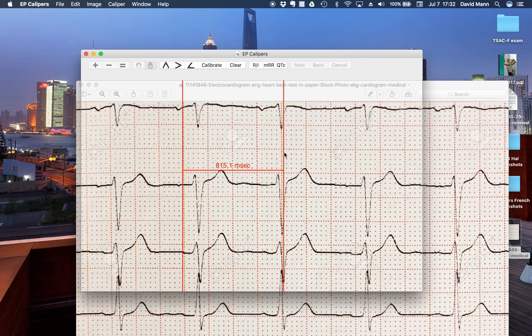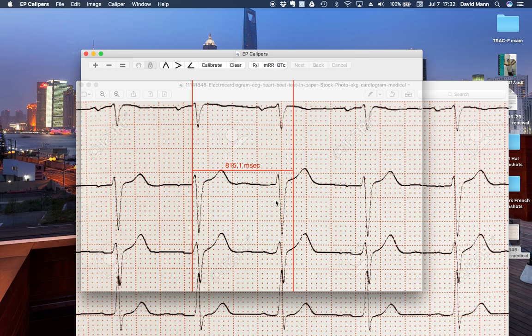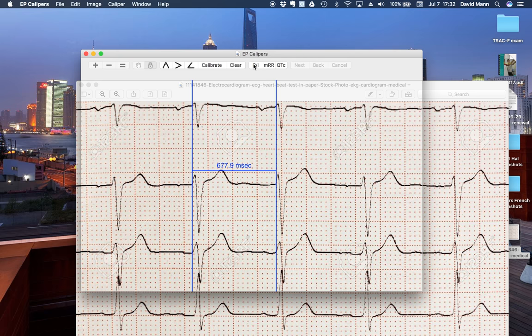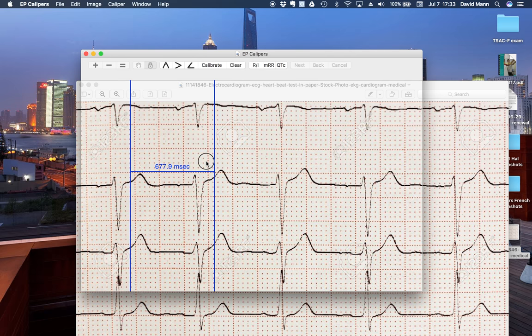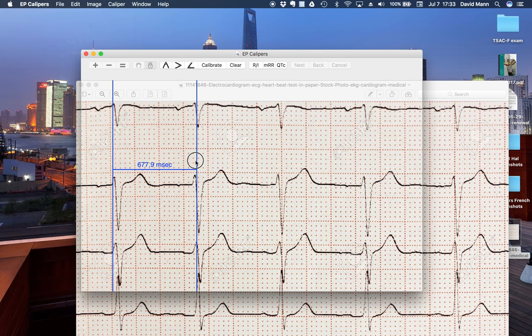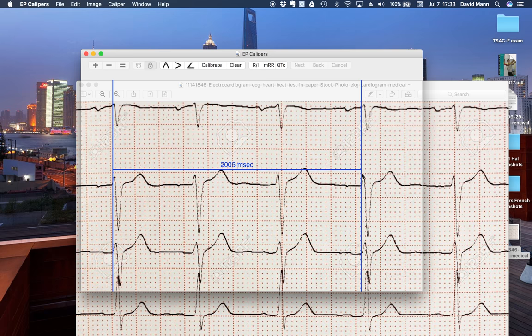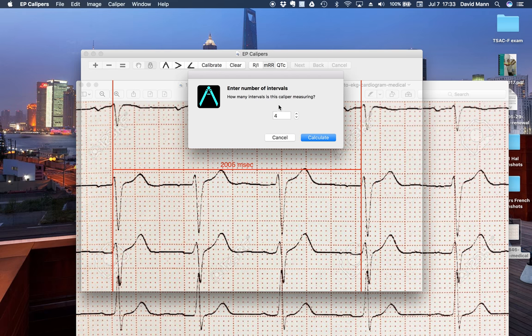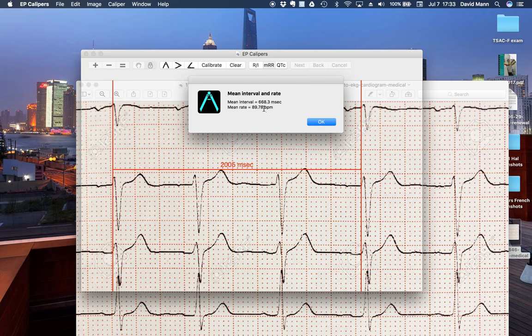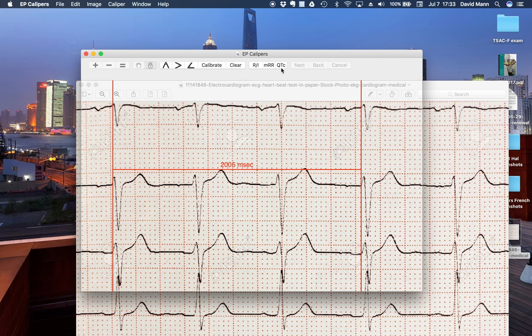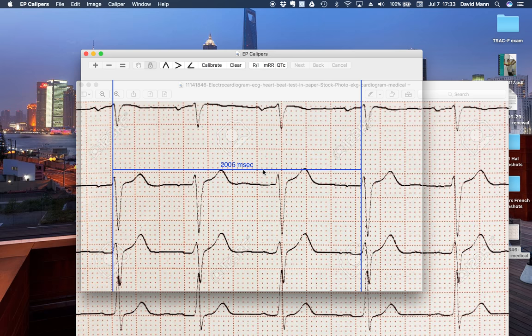And let's make measurements like so for the RR interval. Change it to a heart rate. Do a mean interval. 1, 2, 3. With that. And calculate that. And also measure the QT corrected, which won't do because it's on a different video.